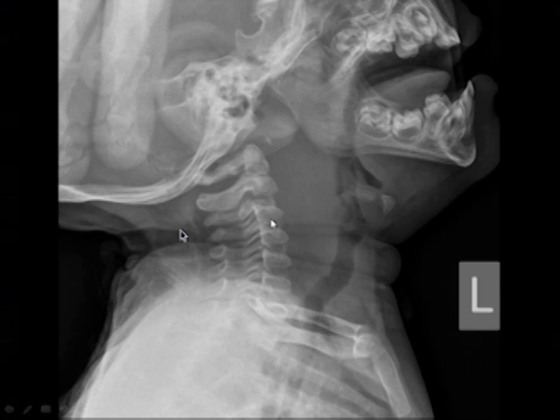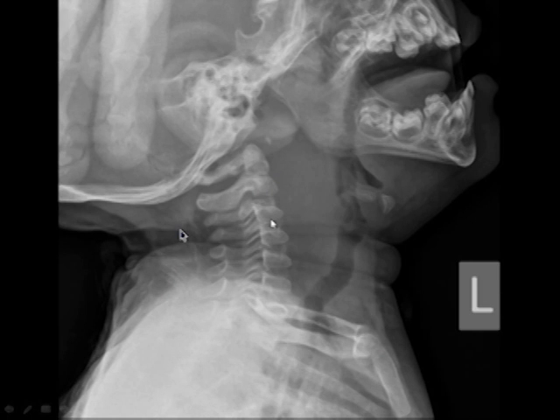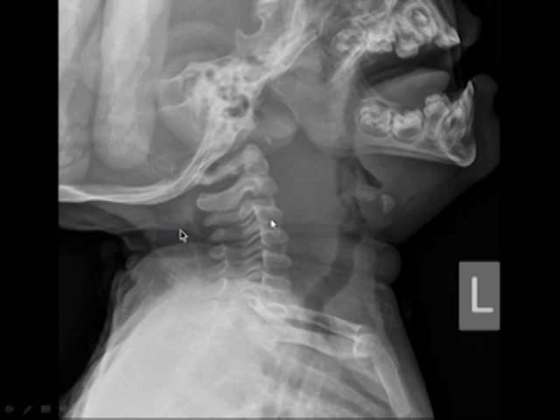Another lateral neck in a child with fever, respiratory distress, difficulty moving the neck, and pain holding the neck in a funny position. Here we also have prevertebral soft tissue widening, but that's not from expiration or neck flexion.